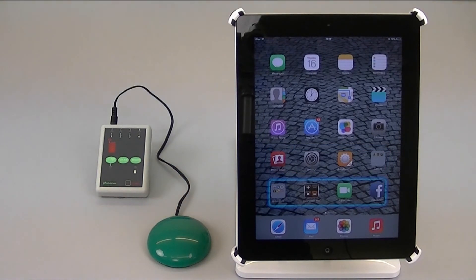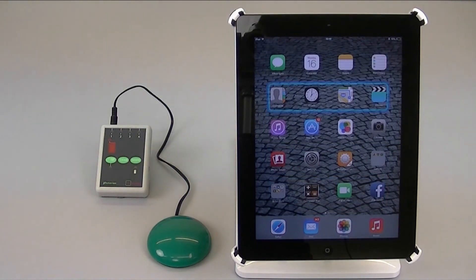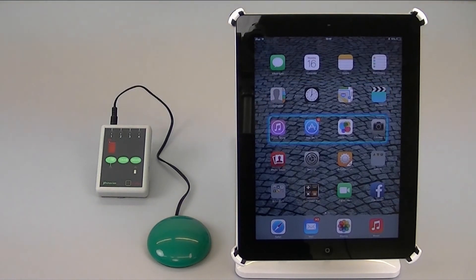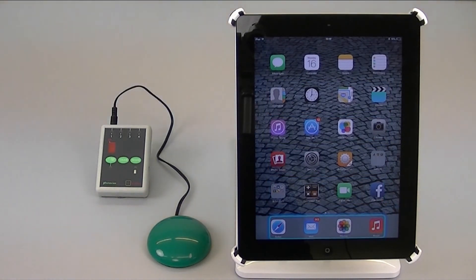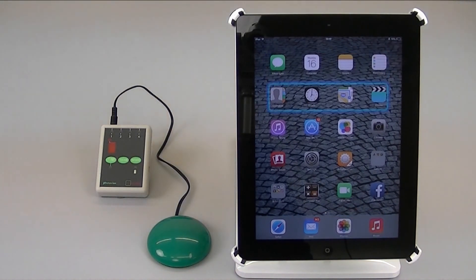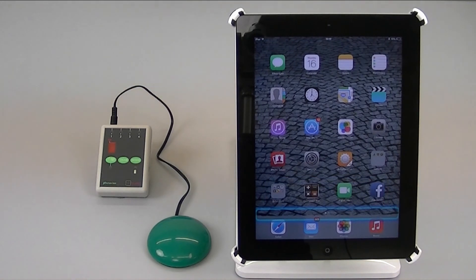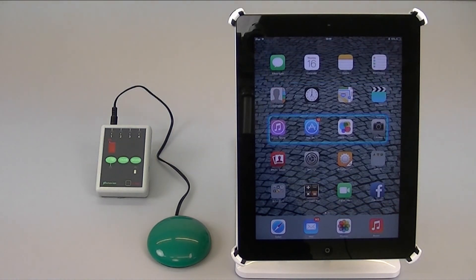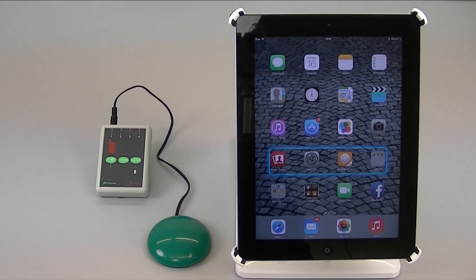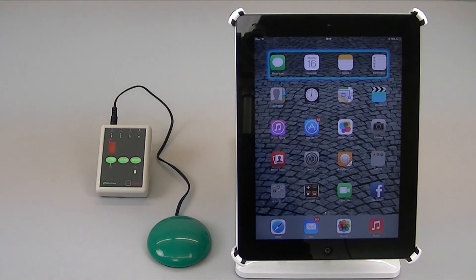So with a single switch you can now do absolutely everything you need to do in auto scanning. You can move between items, you can select an item and open the app, you can navigate within the app, you can navigate the pop-up keyboard, and when you finish using that app you can now get back to the home screen and do something else.